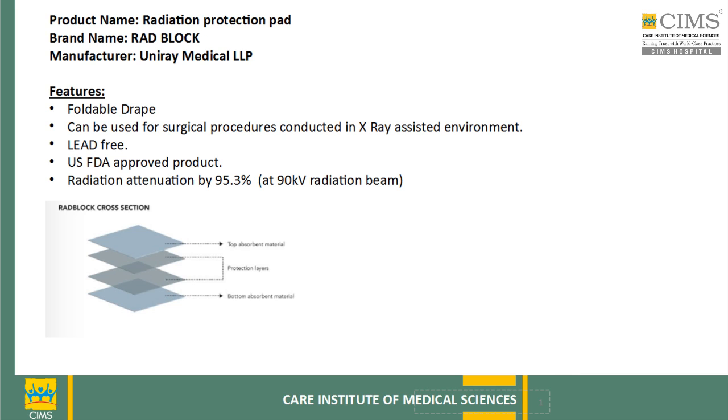Now before we go in with the wire, let me talk to the audience and viewers about various techniques which we use for radiation protection. We use mandatorily almost 4 near field radiation protections on the table.